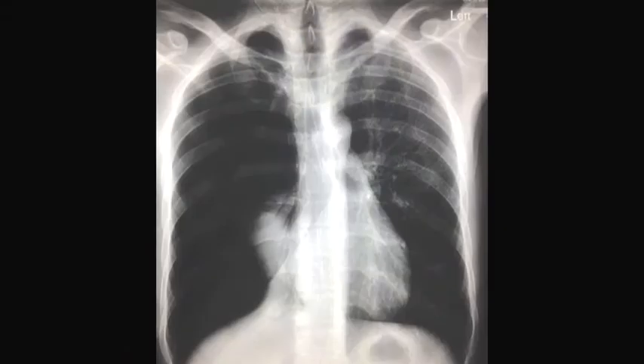This is the x-ray of one of my patients, used with his consent. This is not his right ventricle — it's his entire right lung that has collapsed down into this tiny little knob, and his right ventricle is somewhere over here being crushed by a tension pneumothorax.